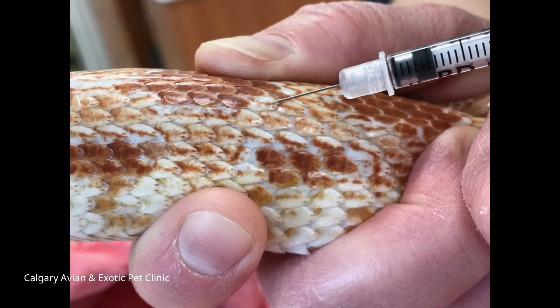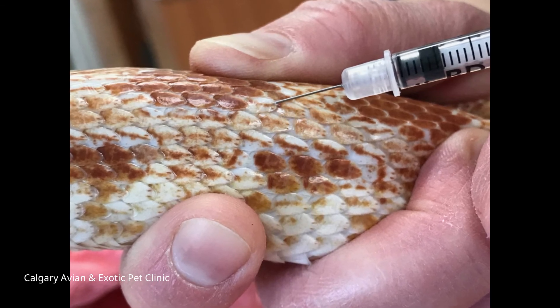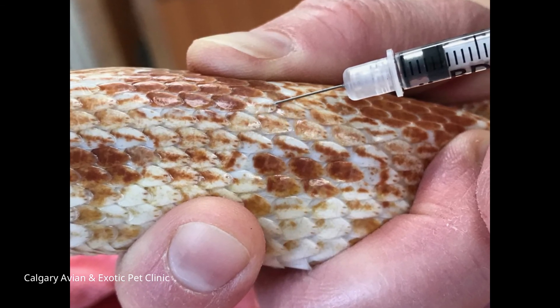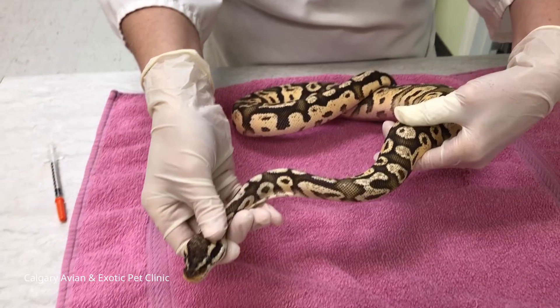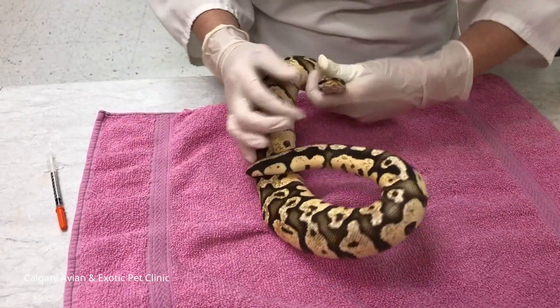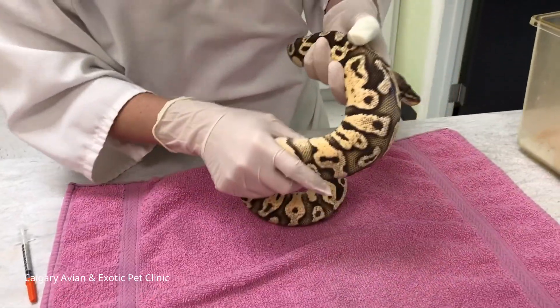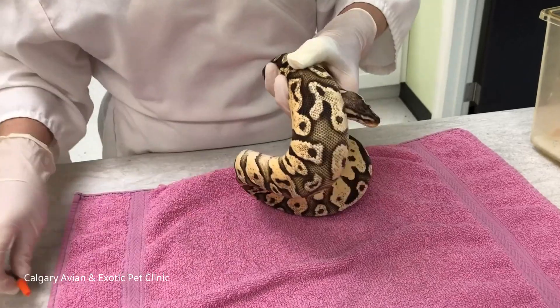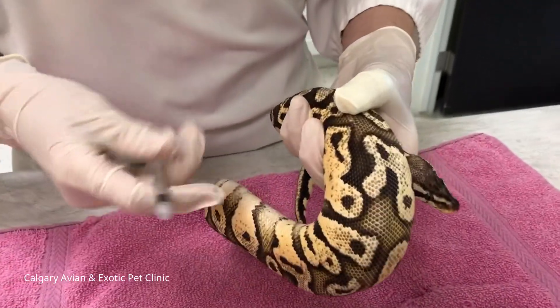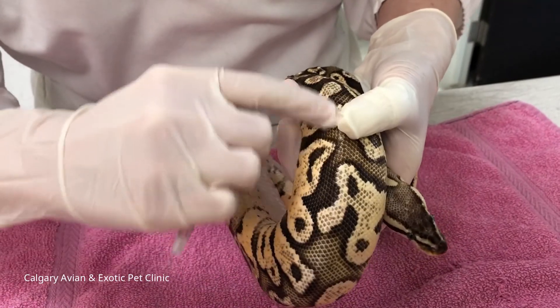Give the injection in the larger muscle areas in the front half of the snake's body. Make sure to insert the needle between the scales at a 45 degree angle, aiming for the middle of the muscle. Keep your needle parallel to the spine. Once your needle has been inserted into the muscle, draw back slightly on the plunger. If you do not see blood, give the injection. If you see blood, take the needle out and retry in another area of the muscle an inch or so away from the first site.